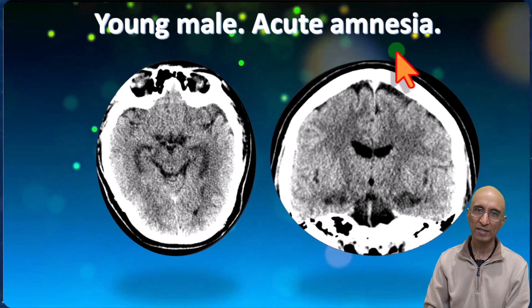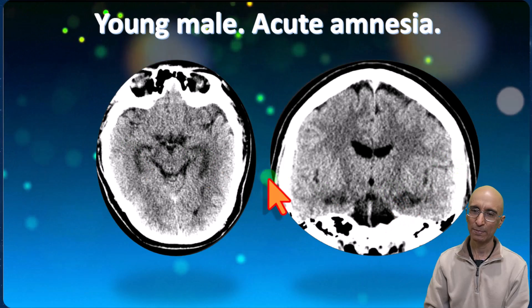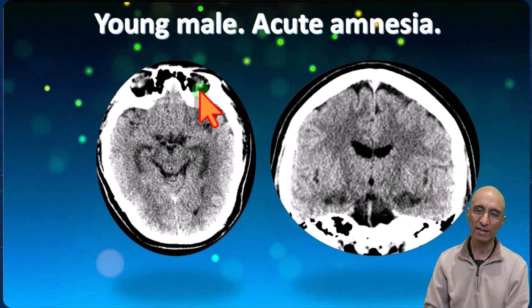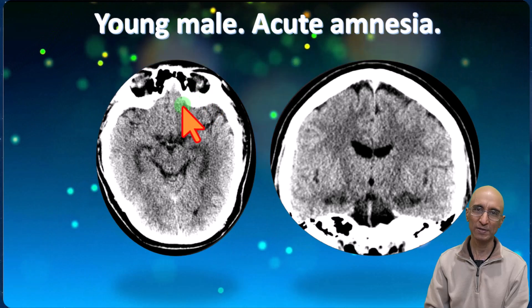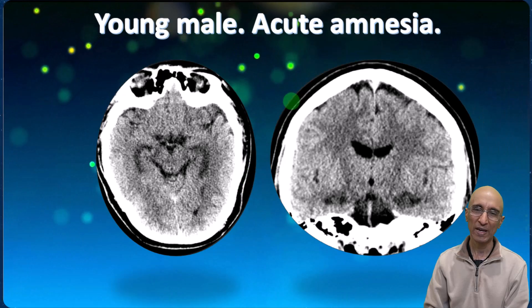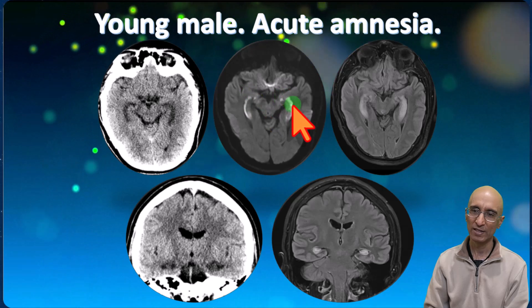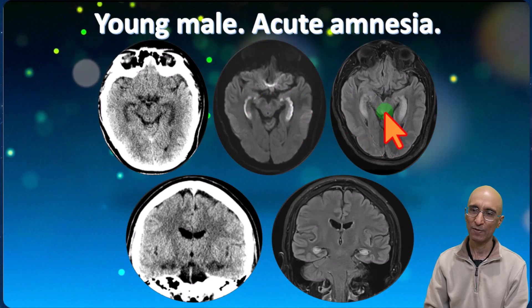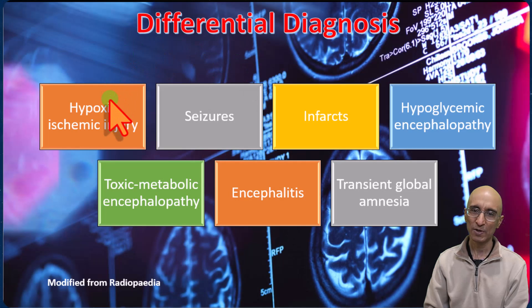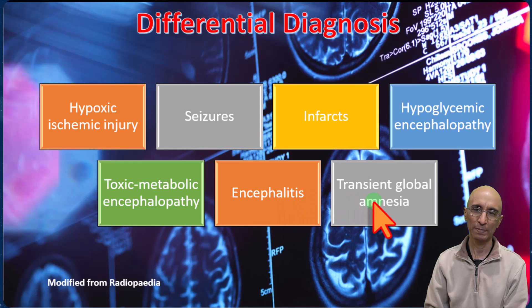Our patient has acute altered mental status with amnesia and hypodensity in the bilateral hippocampi, which was not recognized on the initial CT head evaluation. These findings, because they are symmetric, can be overlooked if we don't pay attention to the clinical details. On MRI, we saw restricted diffusion in the hippocampi with FLAIR hyperintensity. In terms of differential diagnosis, it could be hypoxic ischemic injury, seizures, infarcts, hypoglycemic encephalopathy, toxic metabolic encephalopathy, encephalitis, or transient global amnesia.